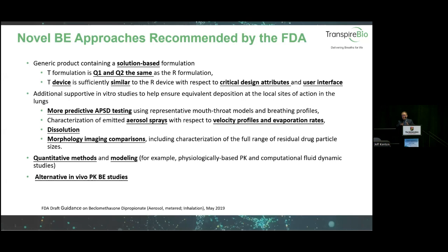So basically, why BDP? According to the guidance document, the BDP aerosol is a solution-based formulation. As long as the test formulation is Q1, Q2 the same as the R formulation, and the device is sufficiently similar to the R formulation device with respect to critical design attributes and the user interface, then we could use these supportive in vitro studies to help ensure equivalent deposition at the local site of action. Over the past 2 days, we heard people talking about more predictive APSD testing, and also a range of in vitro studies, such as aerosol plume velocity, evaporation rates, dissolution, MDRS, and also quantitative methods and modeling, and also potential in vivo PK studies.